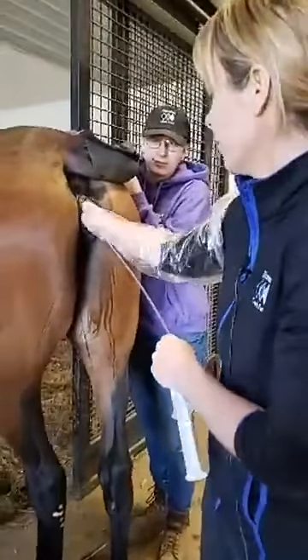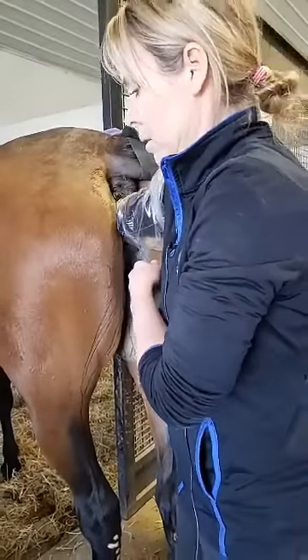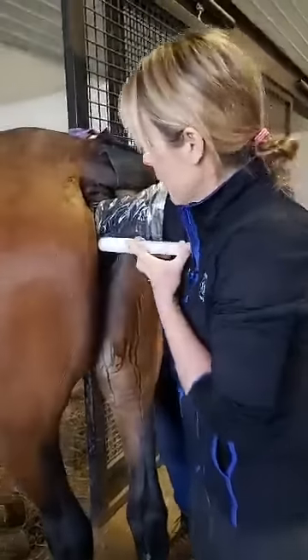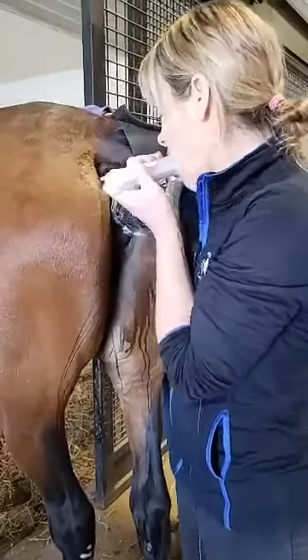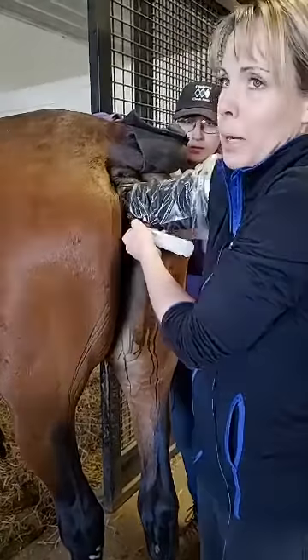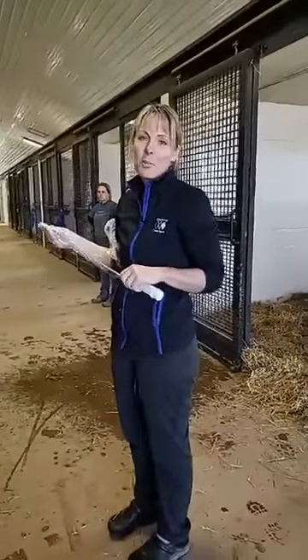A little lube on the outside of her vulva, and I'm going to very gently go into her vagina and feel for her cervix. I'm going to pass one finger through her cervix, slide the pipette down my finger — as you can see it goes pretty far in, so now I know I'm in the uterus. I'm going to plunge the syringe, then get a little air to push what's left in the pipette contents into the uterus. Then I'll pull the pipette back into her vagina, cover it with my hand, and gently come out. There you go — we just bred Piranha Fury, and we'll see you in about two weeks for a pregnancy check.